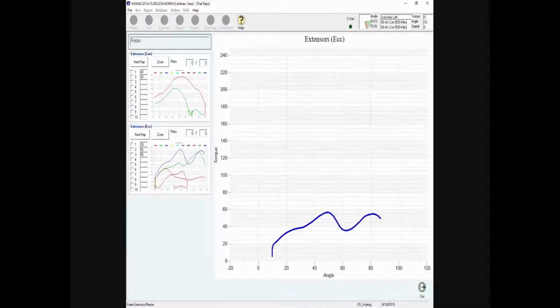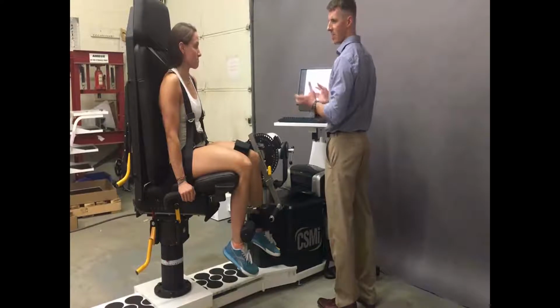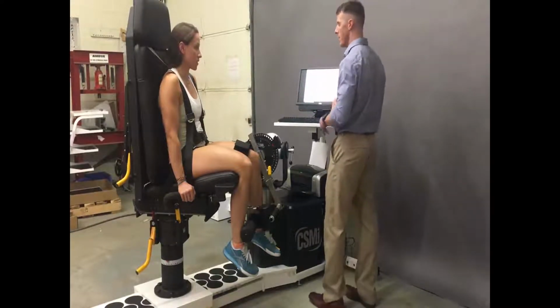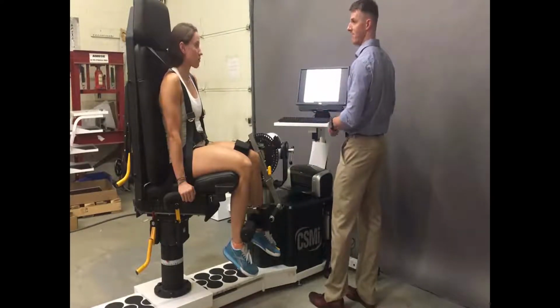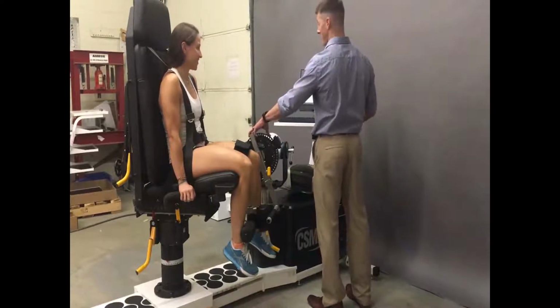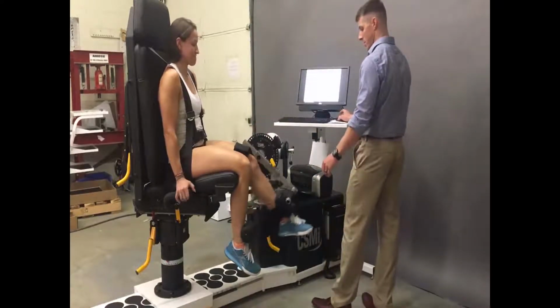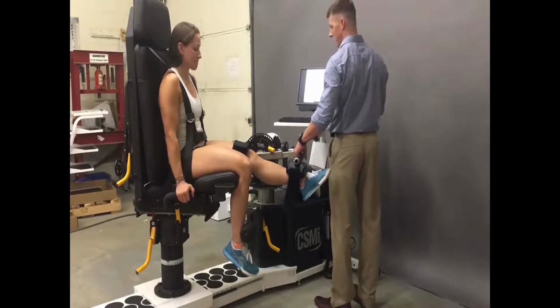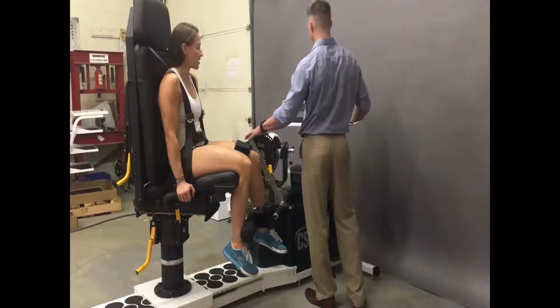So I'm explaining to her here how as we warm up 50, 75, and 100% effort, that we want to keep that pain threshold ideally below 3 to 4 out of 10. If it goes above that, I want her to tell me because we don't want to have her push that hard on that injured limb. So we wanted to have them test at that pain tolerance. Again, about 3 to 4 out of 10 discomfort is okay, but above that we don't want. So we use that 50, 75, and then 100% effort as a way to judge how hard she should push for the test.